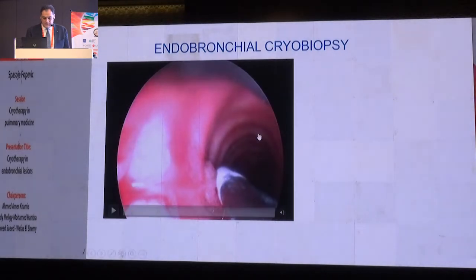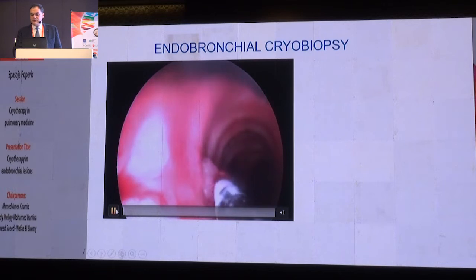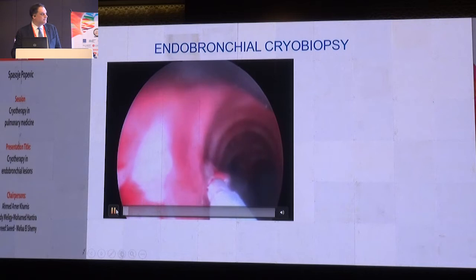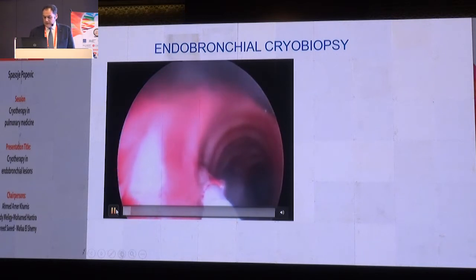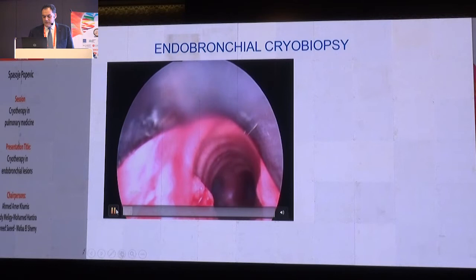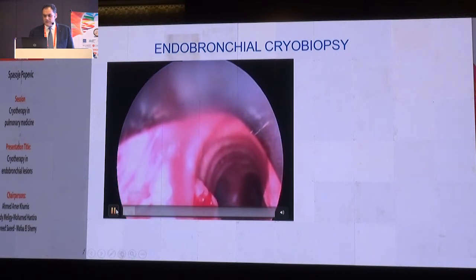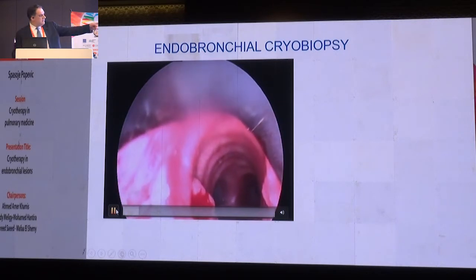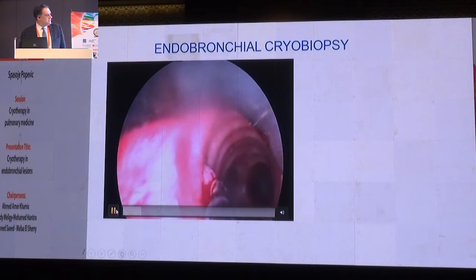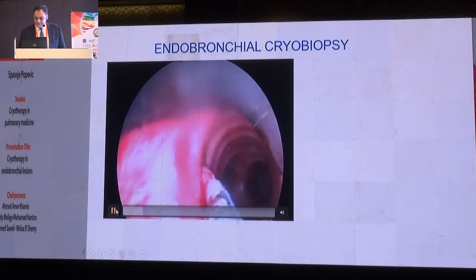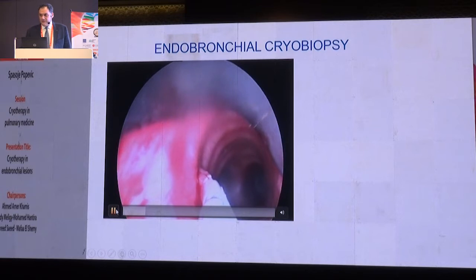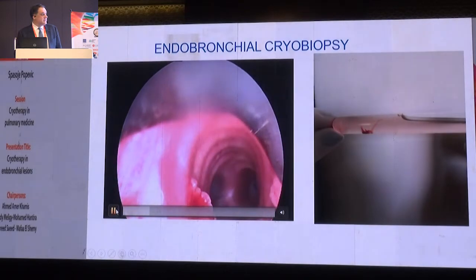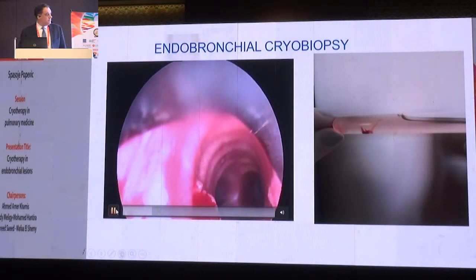Sometimes cryobiopsy can be a cryorecanalization at the same time — both an interventional diagnostic and therapeutic procedure. I did this with a rigid cryoprobe. It was proven to be tracheal papilloma — freeze the tissue and remove it in one piece. It's enough to repeat that biopsy once more and really not more. Bleeding occurred, but it's not very significant. At the same time, we are treating the lesion with the cryoprobe, not just taking a biopsy, and the size of the sample is pretty good.